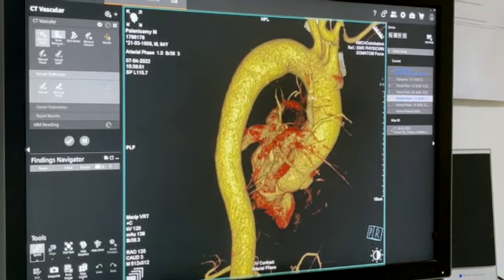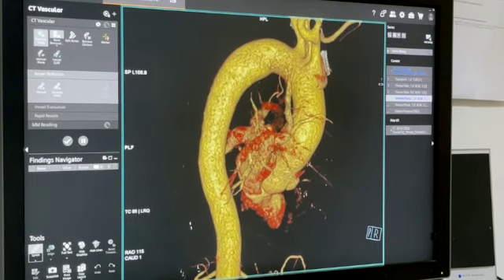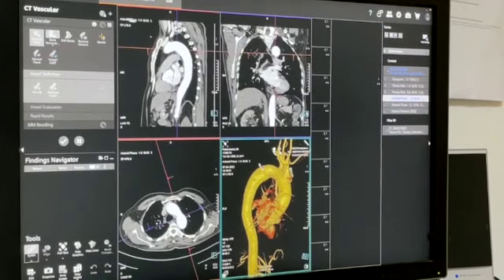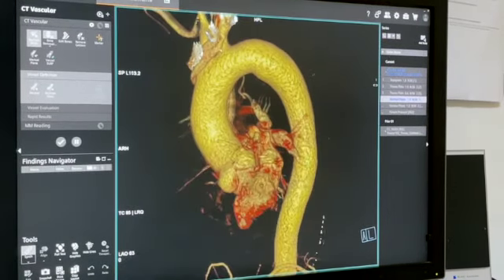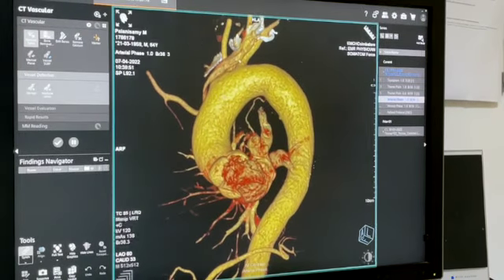Now when you see this, you realize that there are some problems that you will face about, one, what catheter would you use to access, and what is the angle in which you can actually profile this vessel, to hook it. So we want to show you something that is possible on modern CTs.